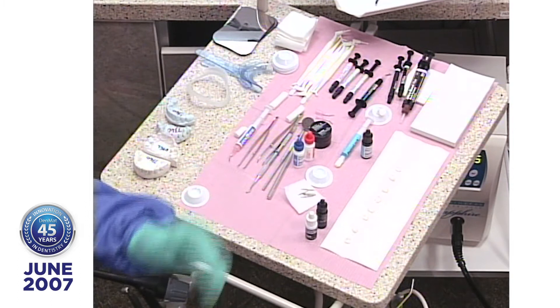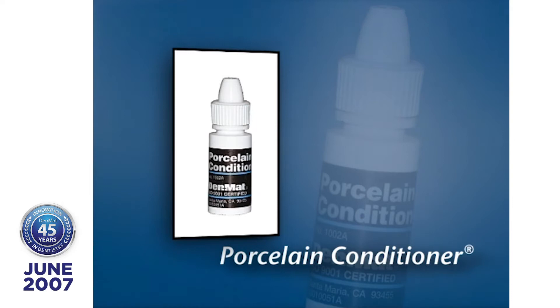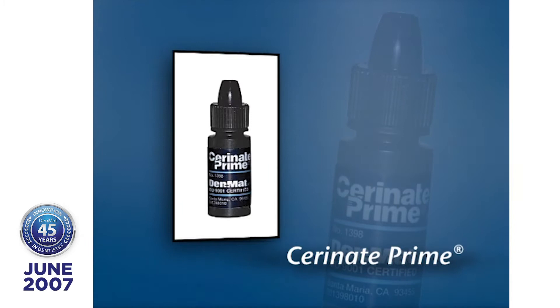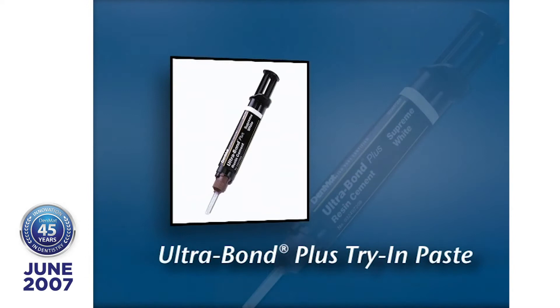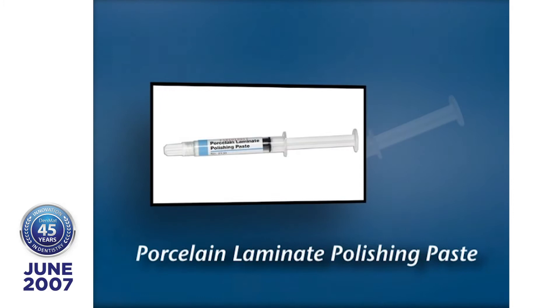On that tray, she's got the pieces of porcelain that she's treated with the citric acid, the porcelain conditioner. That's an important one — it's an organic acid. You need to put organic acid on to activate your silane. Lisa has also polished her teeth with the porcelain polishing paste, which has an enzyme in it, papain. That's what we use to dissolve the plaque on the teeth, so when we apply the etching system, it removes and exposes the enamel so we can get a better etch.